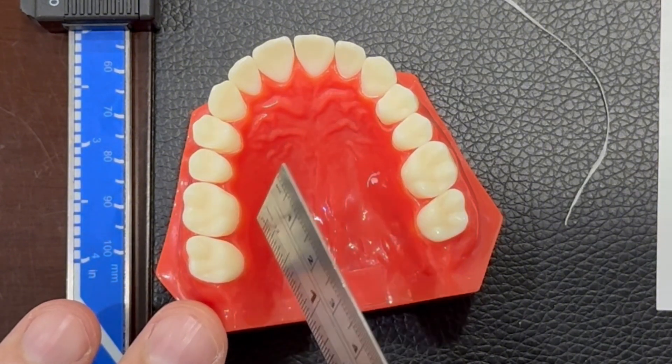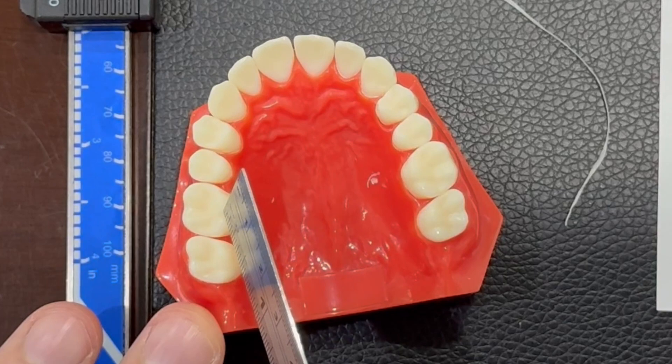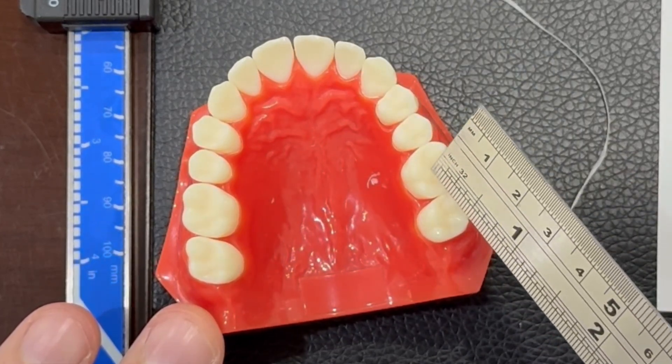The molar is tooth number six if we count from the middle: one, two, three, four, five, six. And the other first molar — the other six from the other side.